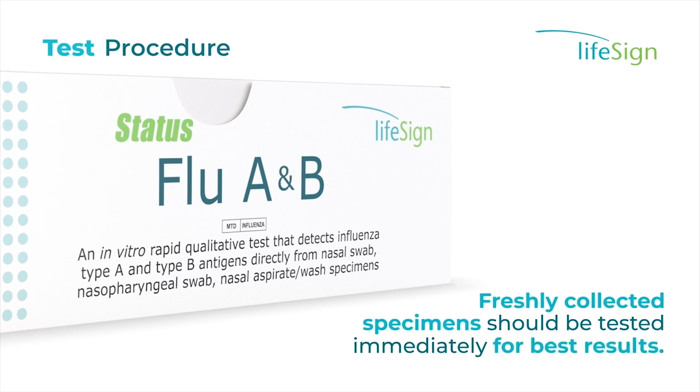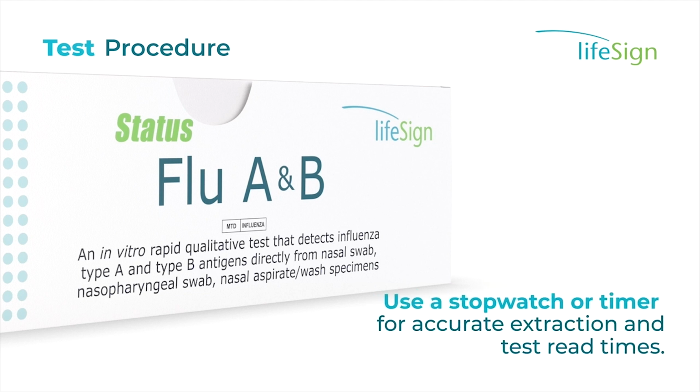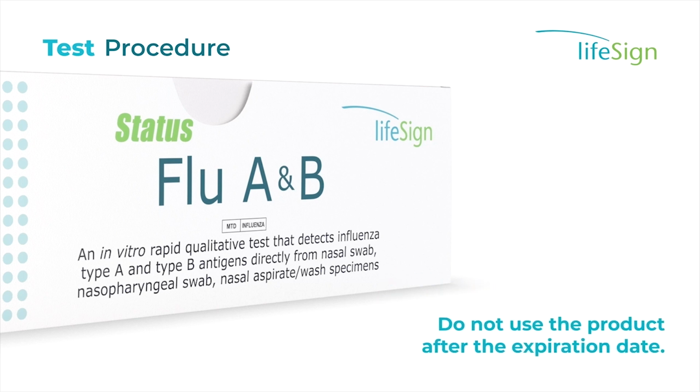Freshly collected specimens should be tested immediately for best results. Use a stopwatch or timer for accurate extraction and test read times. Do not use the product after the expiration date.